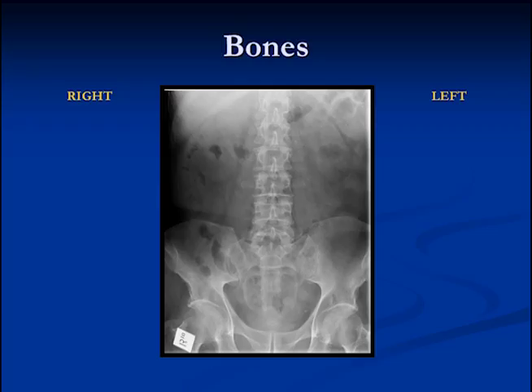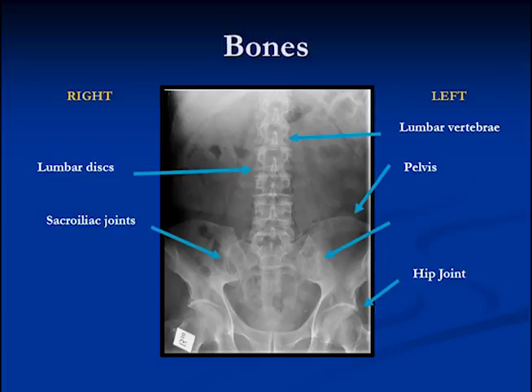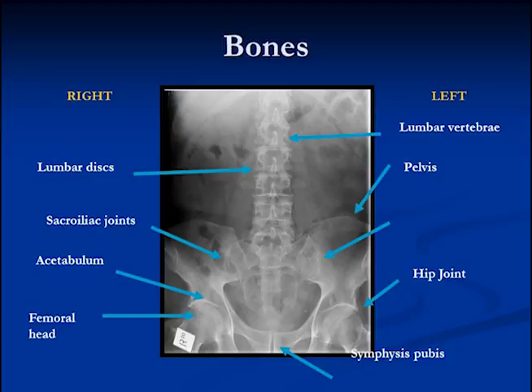This is a plain film of the abdomen, called a supine AP view. In the center we have the spine — these are lumbar vertebrae, and between the vertebrae are the disc spaces. This is the bony pelvis with the sacroiliac joints on each side, the hip joints, the symphysis pubis, the acetabulum, and the femoral head. See if you can name all those structures without me telling you what they are.